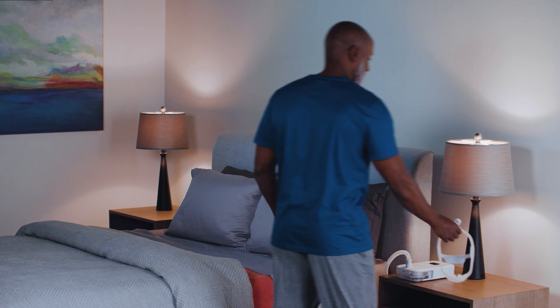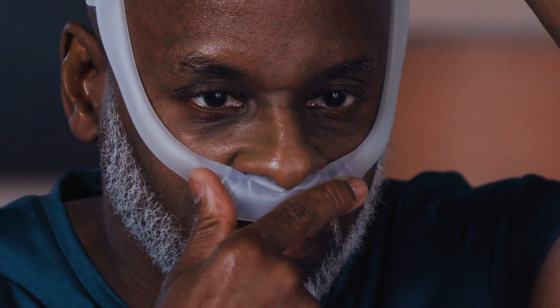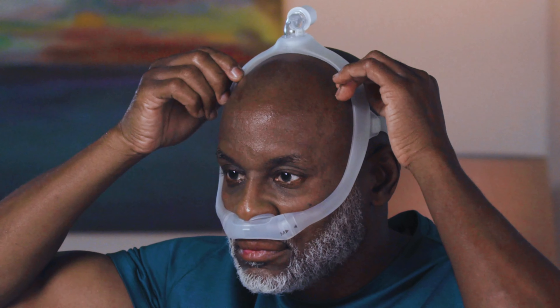The Philips Dreamwear Silicone Pillows Mask is easy to adjust and wear. Place the cushion under your nose and insert just the cushion tips into your nostrils. Hold the cushion in place while you position the frame and pull the headgear over the back of your head.